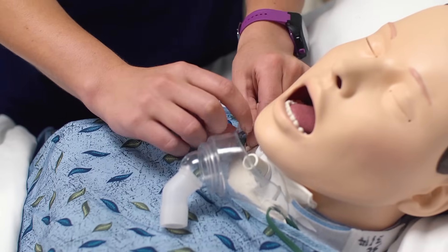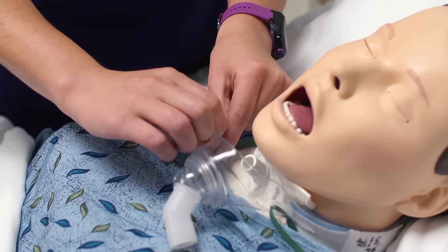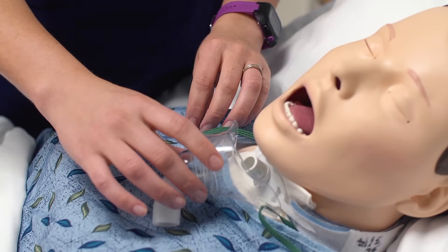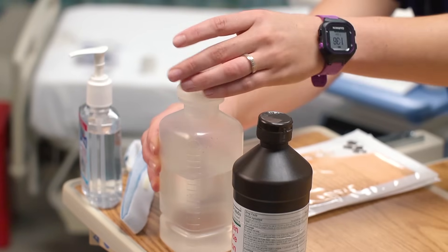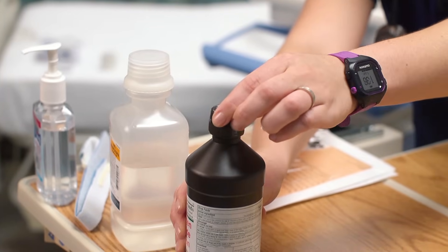I want to go ahead and loosen the mist collar so it's easier to remove. I'm going to loosen the cap of my sterile normal saline and the hydrogen peroxide as well.